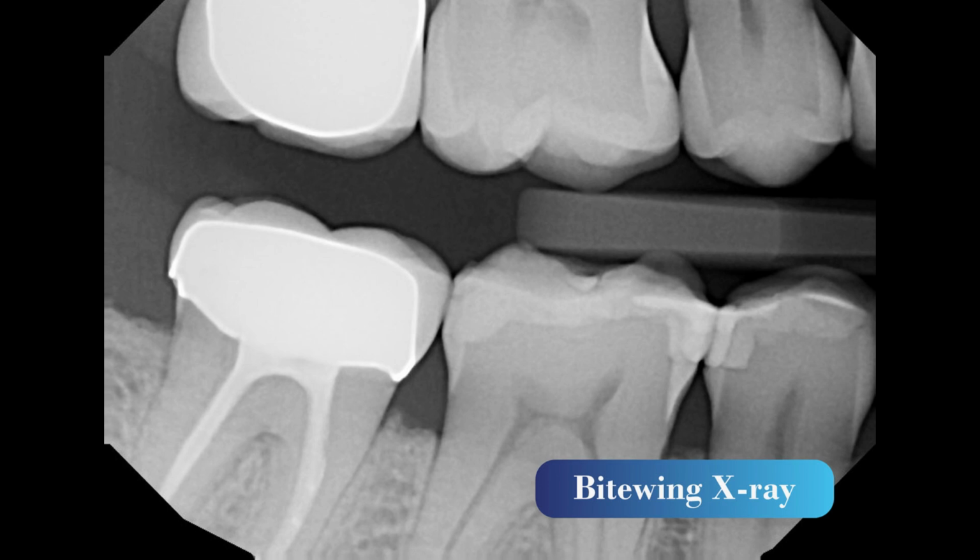In this next bite wing, we're going to talk about restorations that we can see on a bite wing. There are many things that x-rays allow us to see. They are a window into our patient's health, and they are required for proper diagnosis and screening. This allows us to look at the anatomical structures, but also the existing dental work as well.